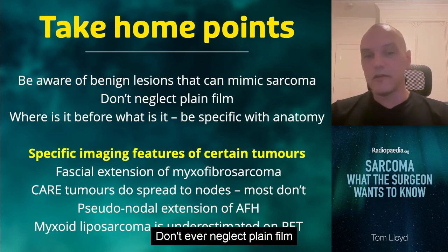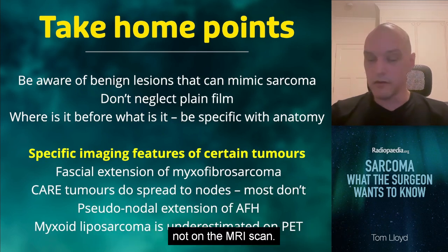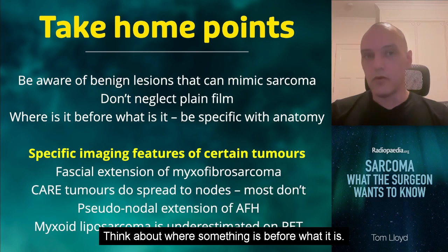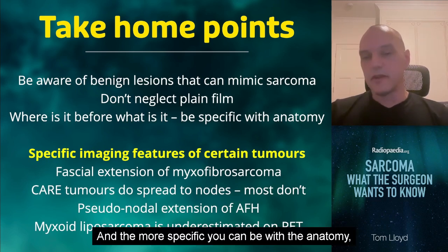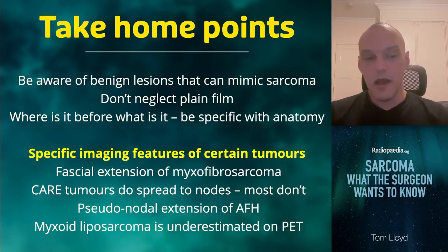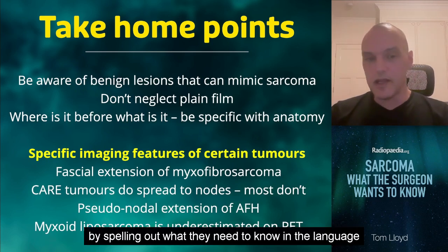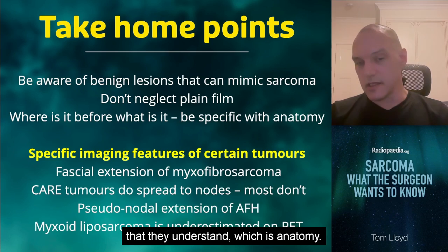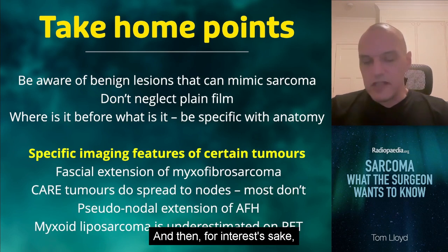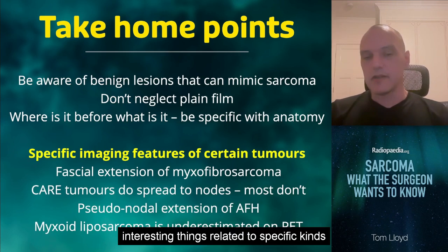Don't ever neglect plain film, because oftentimes the diagnosis is on the X-ray, not on the MRI scan. Think about where something is before what it is, and the more specific you can be with the anatomy, the more people will listen to you and pay attention to what you have to say, because the more help you are to the surgeon by spelling out what they need to know in the language that they understand, which is anatomy.